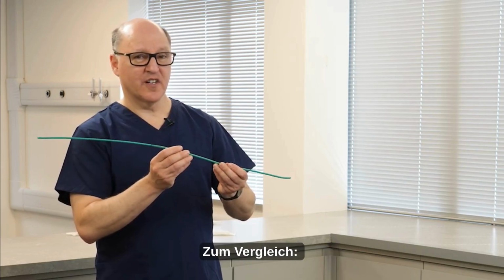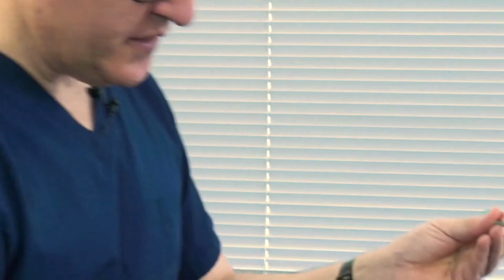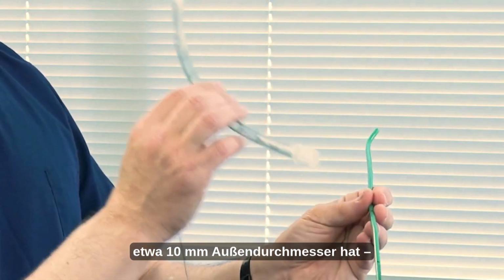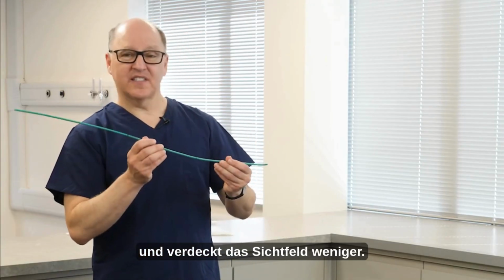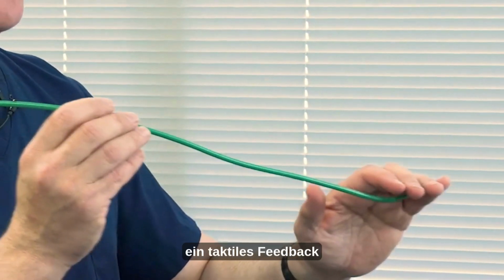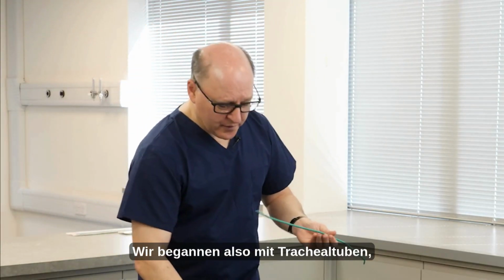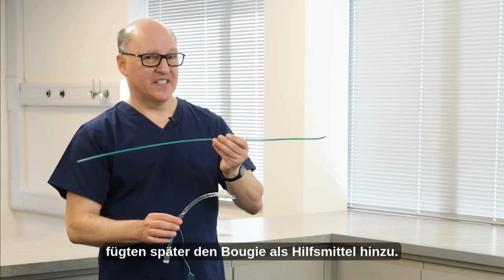And that's advantageous as we approach the target, because on placement, the Bougie's 5 millimeter outer diameter versus this tracheal tube, for instance, which is a 7.5 millimeter and has an outer diameter of 10, the Bougie is half the outer diameter. So it's easier to place this towards the target without blocking the line of sight. Additionally, it has an upturned distal deflection, which, if oriented correctly, gives you tactile feedback of the tracheal rings. So we started with tracheal tubes, moved on to adding a Bougie to assist with this.